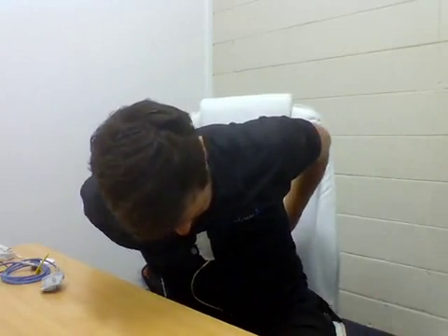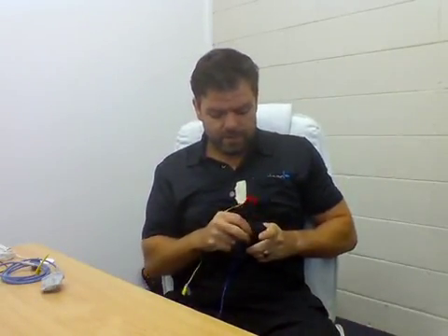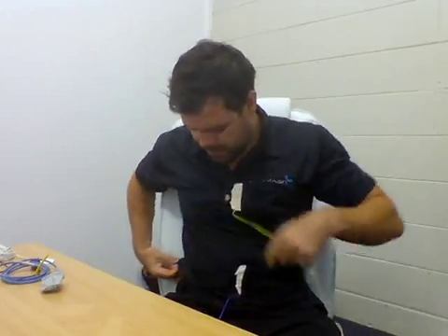Have it just tight enough so it's going to stay where it is. You don't want it so that it's hurting you or anything like that. But that's going to stay where it is, and this yellow cable hangs down from the bottom straight in front, and we're going to do the same with the blue. So I guess if you start with the blue cable just hanging straight down and put it on your belly button, pass it around the back. And the same thing, you're just going to pass it through the little buckle. So just pass that through, back around in itself again.